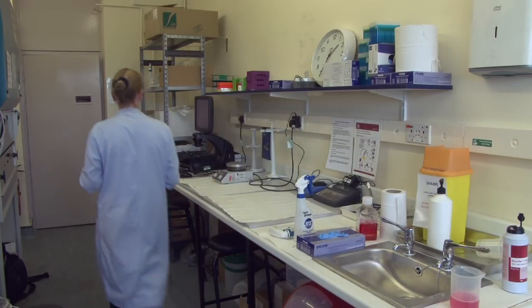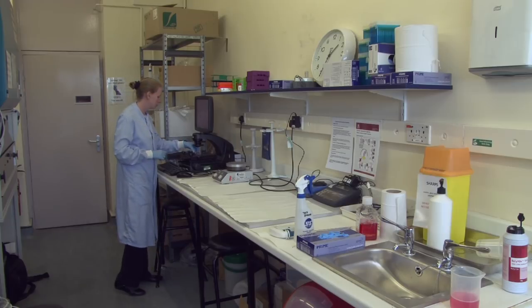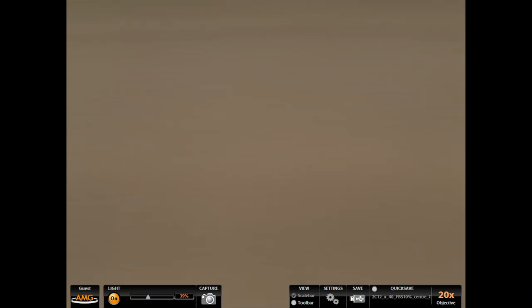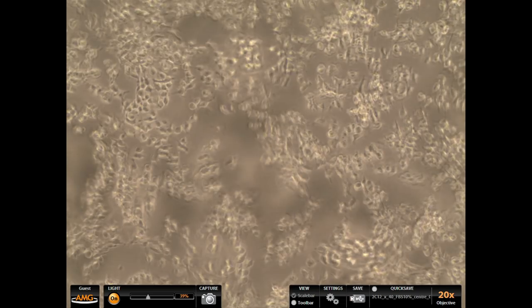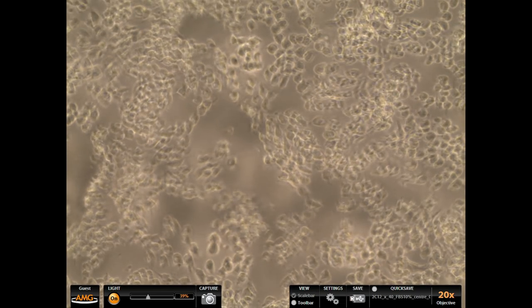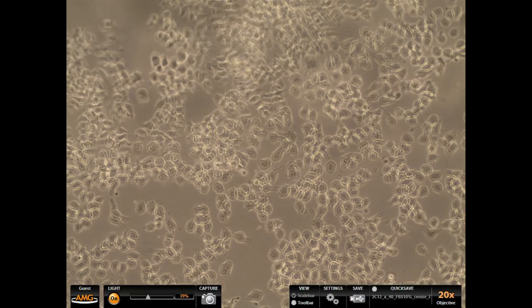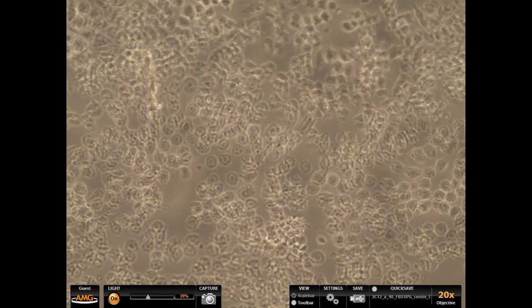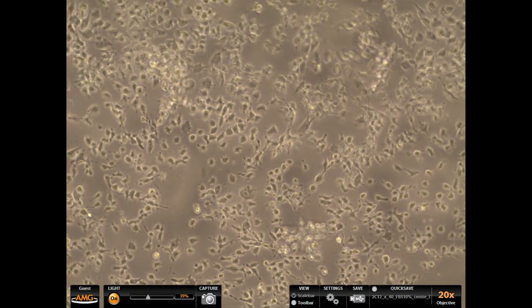After incubation, visually inspect the flask on the microscope. The cells should be beginning to detach. Ideally they should appear spherical, but still be attached to the plastic. If they're all floating free, they've been trypsinized too much.